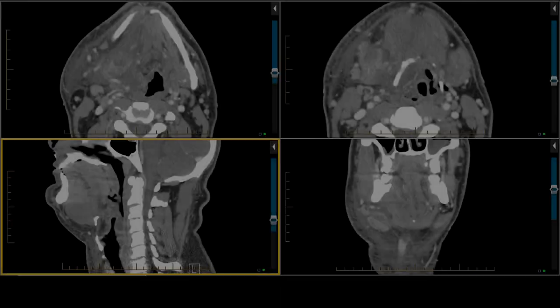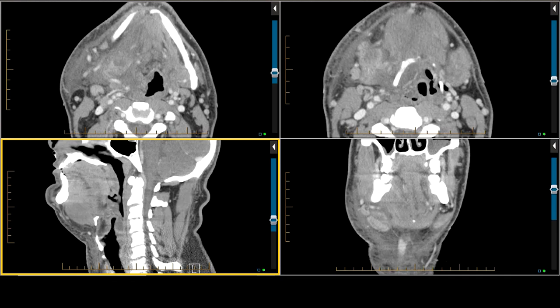This is a classic example of a patient that presents with pain, fever, difficulty swallowing, and a lot of jaw pain, and has a rip-roaring infection. When we look at the contrast enhanced CT scan, what we see is diffuse edema and phlegmon involving the right side of the floor of the mouth that's extending into the submandibular space, with thickening of the platysma muscle and also reticulation of the subcutaneous fat. The majority of this phlegmon and inflammatory process is located within the floor of the mouth.